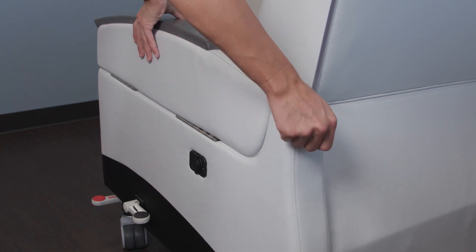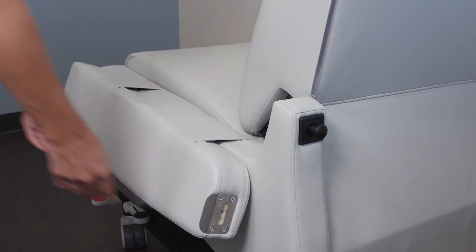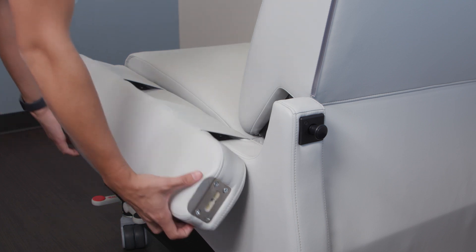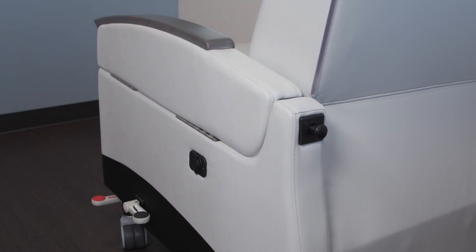Patient transfer arms are available in single and dual-sided configurations, allowing easier access to the patient by a caregiver and enabling safe, gentle movement of a patient to a wheelchair or bed when coupled with the recliner's ability to lift to a matching elevation.